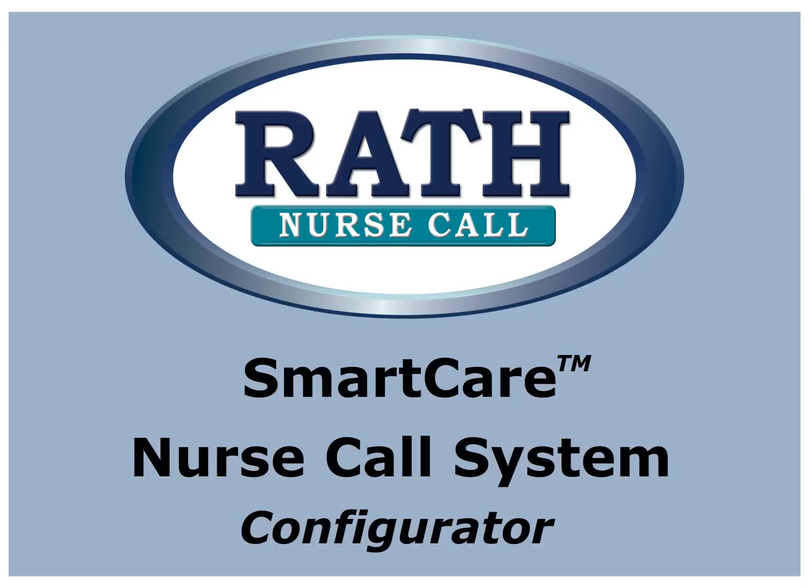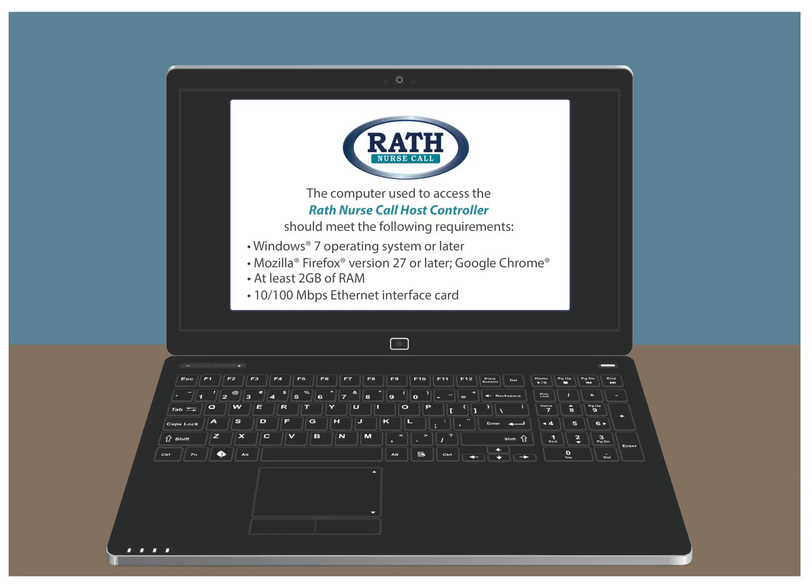Chapter 4: Configurator Software. Now that the SmartCare system has been installed in the facility, we can complete the configuration programming. Like the pre-configurator, your laptop will require a Windows 7 or later operating system, Mozilla Firefox or Google Chrome, at least 2 GB of RAM, and a 10/100 Mbps Ethernet interface card.